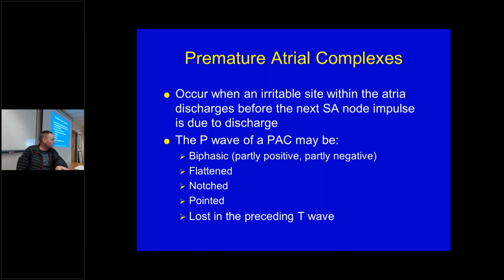And if they're going really fast, sometimes you can mistake them for atrial fib. If they're not in a pattern like a bigeminy, trigeminy, but they're excited enough to be present, it'll be like every 2, and then every 3, and then on the third one, and then on the second one, and then on the fourth one, then on the fifth one, and you won't see any P waves because it's tacking away, and you can't see the P waves because they're hidden in the T waves. And what will it look like then? It'll look like AFib. You won't see any P waves, and it'll just look irregular. So sometimes AFib and tachycardia with frequent PACs will look the same. Does that make sense of why it would look the same?